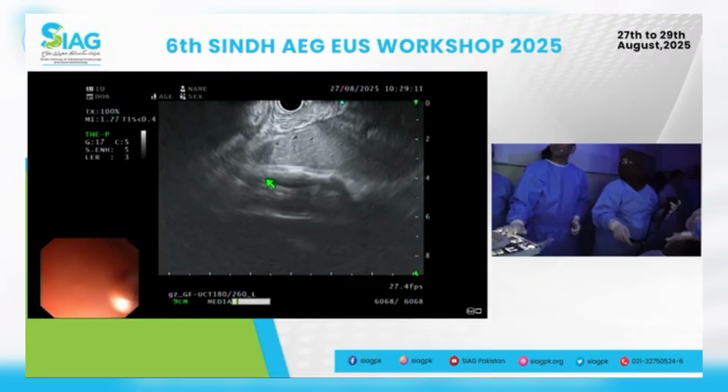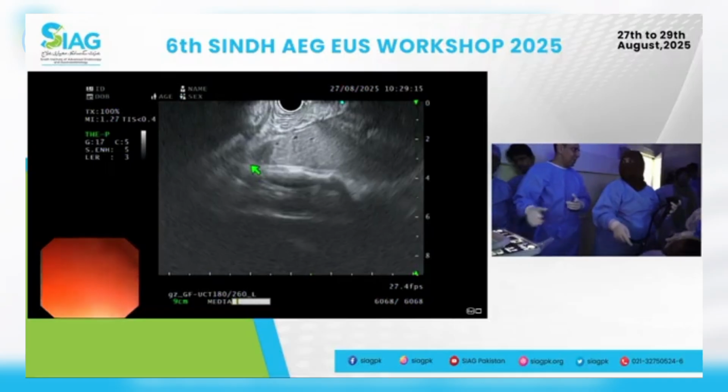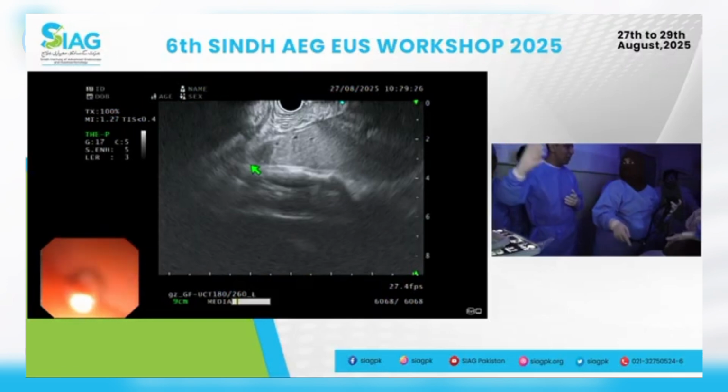Yes, exactly. So what you want to do when you start this examination is make sure there's no perihepatic ascites. Again, it's to do with the staging. So there's no perihepatic ascites. Another advantage is if something happens during the procedure, especially in therapeutic procedures, and there's any fluid or air around it, then that's where it accumulates. So you've started the procedure. There's no perihepatic ascites. It otherwise looks okay. It helps with the staging. Fine.